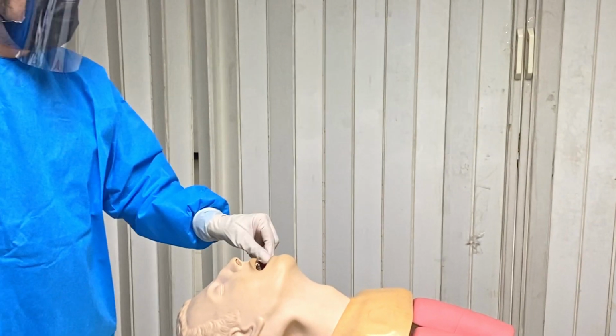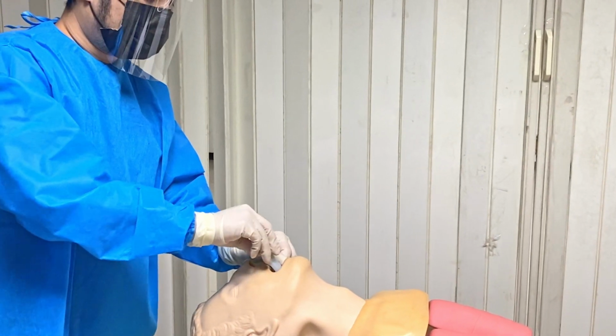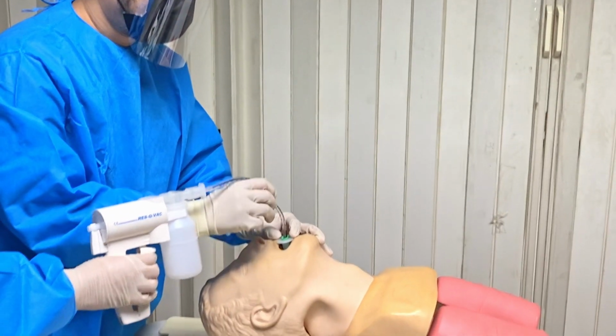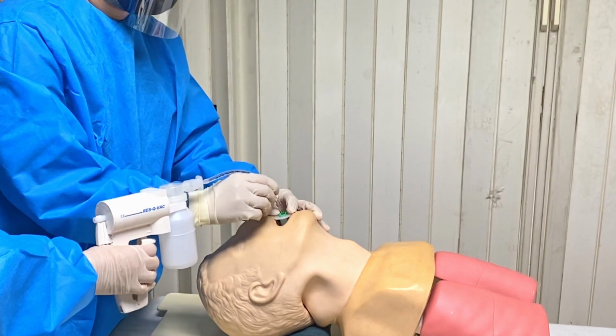For our patient, many folded towels or a commercial ramped device may be needed to sufficiently elevate the shoulders and neck. For basic airway, first suction the secretions and vomitus that may obstruct the patient's airway. For obese patients, you may use an oral airway to aid you in suctioning secretions.